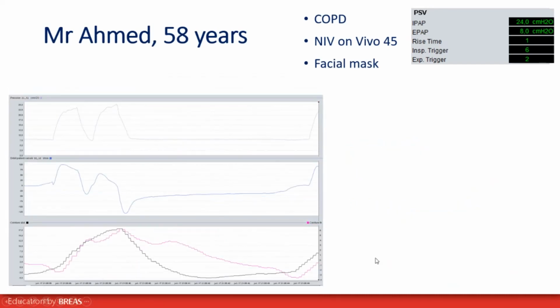And in the same patient a little bit later, we have this shape, which starts with a normal breath, but the first breath is very short, and then the patient is able to trigger a second breath. If we look at the belt, we realize that the patient is doing one single, quite long effort.